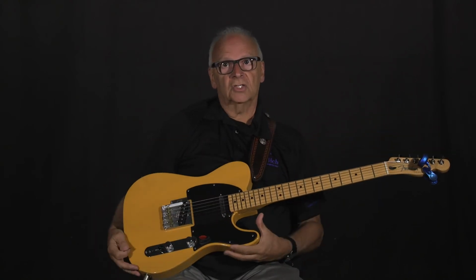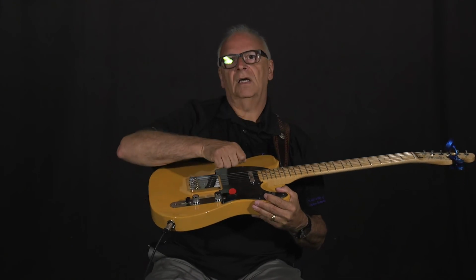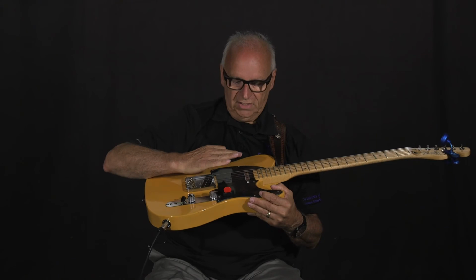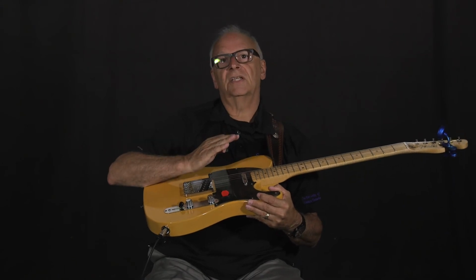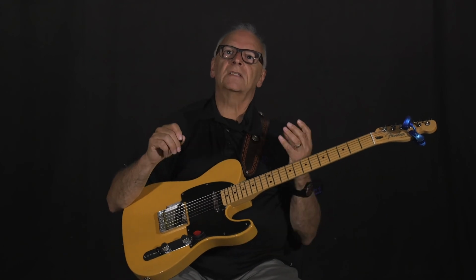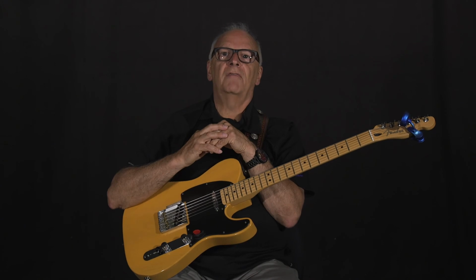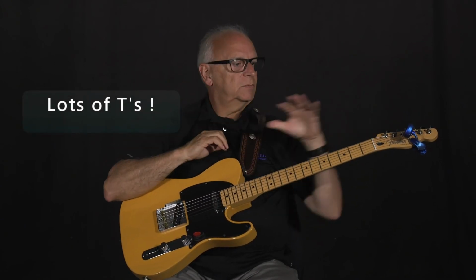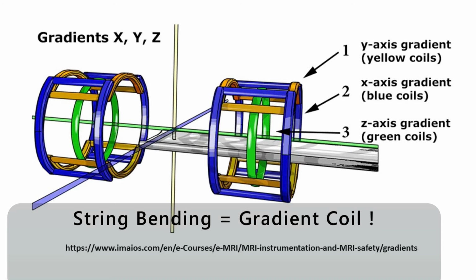On other guitars as well, you will have a whammy bar back here, and when you depress or pull on that whammy bar, you're actually releasing the tension or increasing the tension on the strings. The reason I raise this is that in magnetic resonance imaging, the main tension or the main field strength, Tesla, on an MR machine is basically these tuners. But there are ways of changing the frequencies just a little bit, and that's through the use of gradient coils.